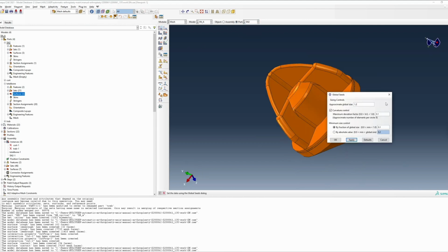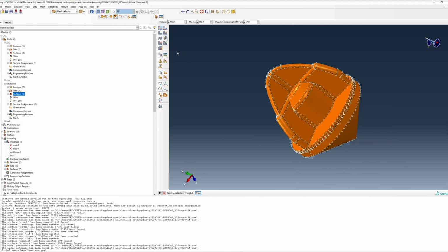Here, I'm just meshing my implant model with the same settings that I used for my bone model. You may want to apply mesh controls to your own model dependent on the requirements of your own analysis.